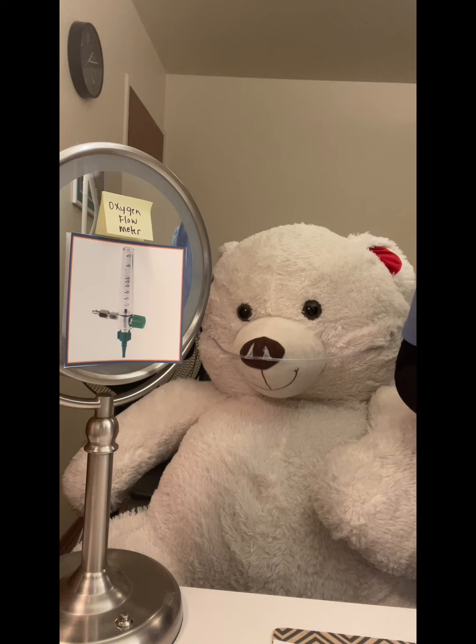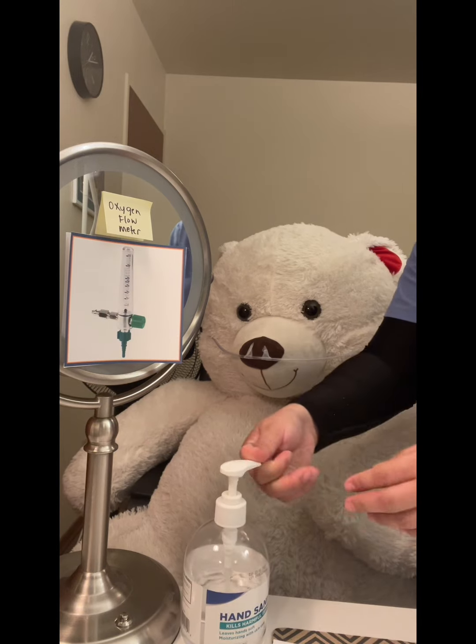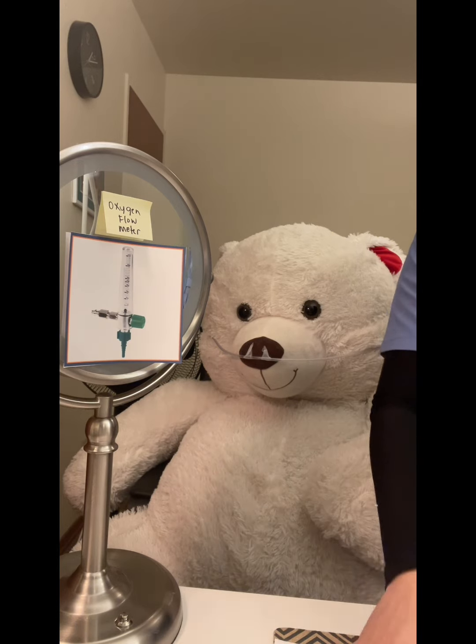And then I will inspect the equipment regularly. I will check the flow and the level of water in the humidifier. I will ensure that the water is not collecting in the tubing loops and that safety precautions are followed. And then I will perform hand hygiene. Then I will document all the findings in the patient record.